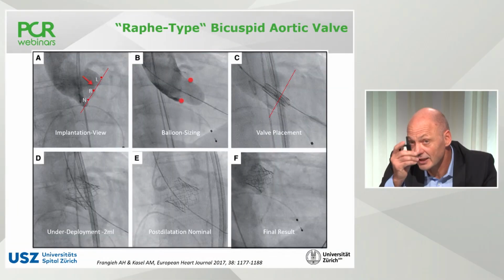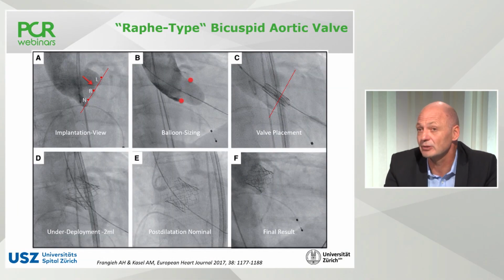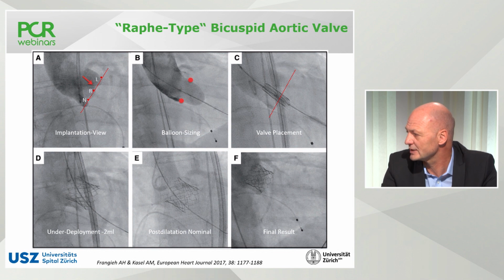And once again, high positioning is really also one key point. But when you use a supra-annular device and you place it high, then what's in the future with the coronary access? So that's always my concern. Yeah, this is an important aspect. What about advances in skirt technology, Marcus?